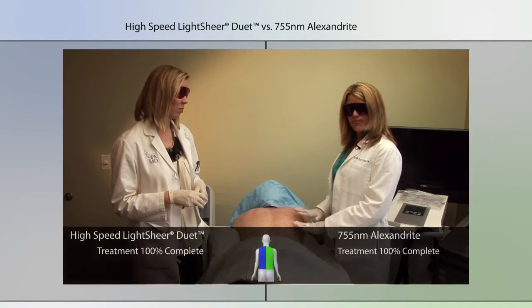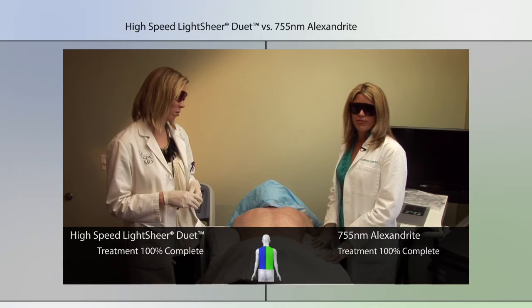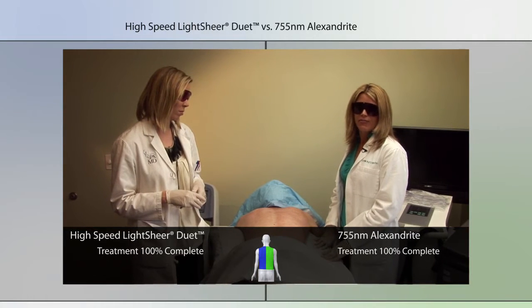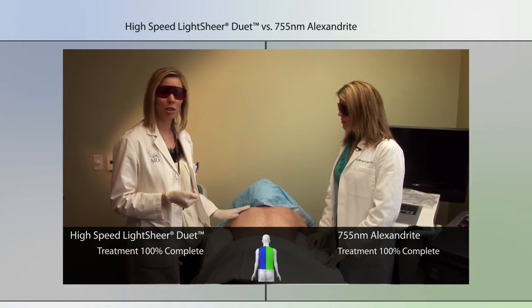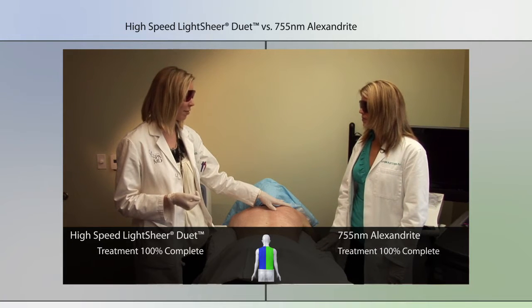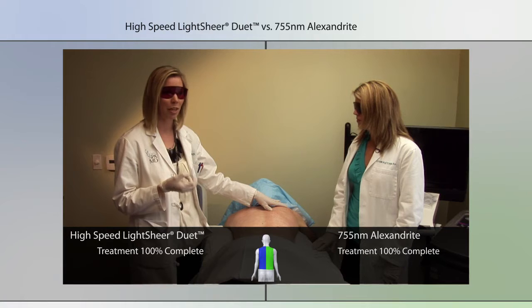I had to use ice packs prior to, and the Zimmer cooling device throughout the treatment to try and keep the pain to a minimum, and apparently he was still experiencing a significant amount of discomfort. So we just wanted to take a moment after we're done with treatment to actually compare the two sides. This was the side that was treated with the Alexandrite 755 nanometer spot size with some pre-cooling prior to treatment, and there was active air cooling during the treatment.